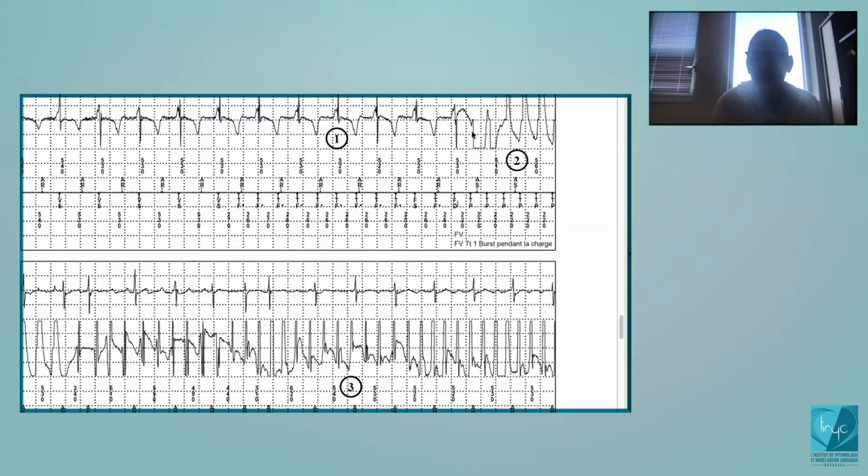In this case, you see the patient, but if there is a high threshold and you induce an arrhythmia, you may not see the patient again, and you may not see the tracing of the death of the patient, so you may not know that that was the problem. But I don't think this kind of situation is very infrequent. Okay?